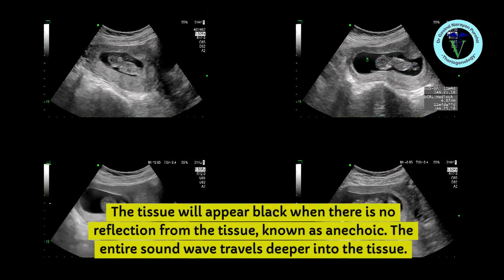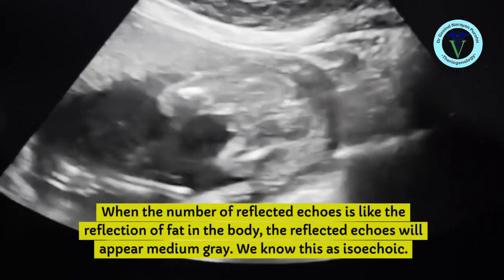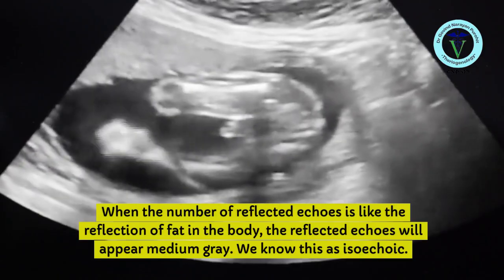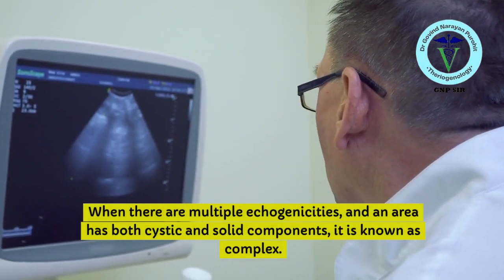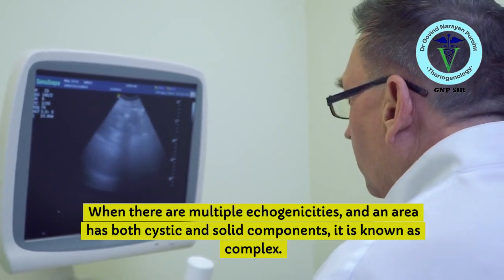The entire sound wave travels deeper into the tissue. When the number of reflected echoes is like the reflection of fat in the body, the reflected echoes will appear medium gray. We know this as isoechoic. When there are multiple echogenicities, and an area has both cystic and solid components, it is known as complex.